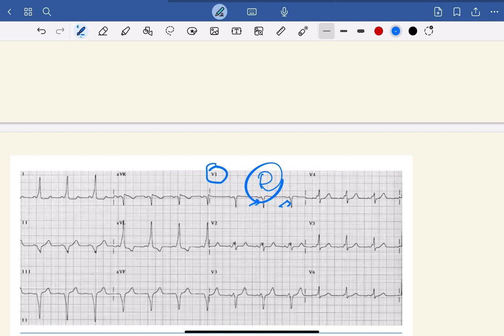See here, lead 1 is showing positive waves and lead AVF is showing negative waves. So left axis deviation is there. When left axis deviation is there, anterior septal is ruled out, because in anterior septal normal axis will be there. So now we are left with posterior septal and free ventricular wall.